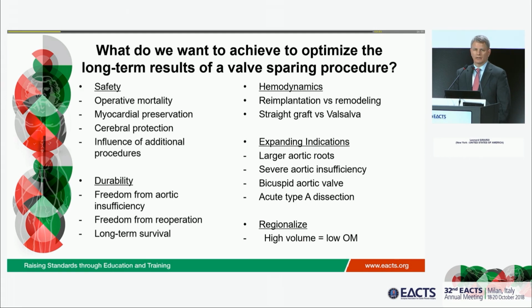Reimplantation and remodeling, again, for all intents and purposes, currently would be considered equivalent. However, whether we have a straight graft or a Valsalva graft and what are the advantages and disadvantages of maintaining those sinuses remains to be seen.